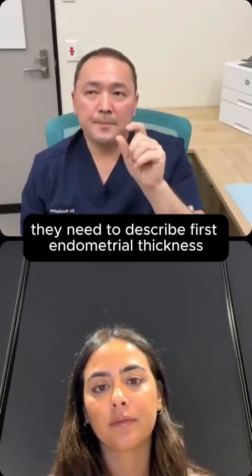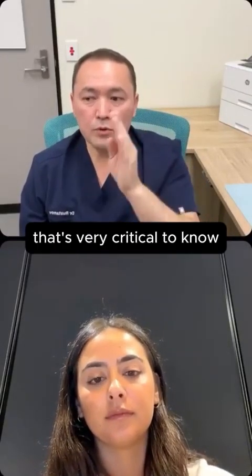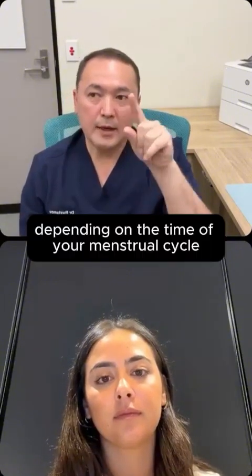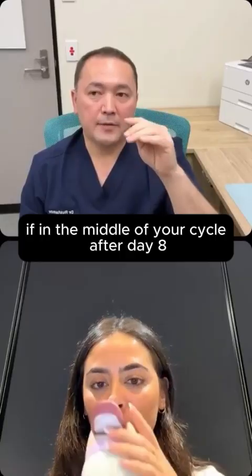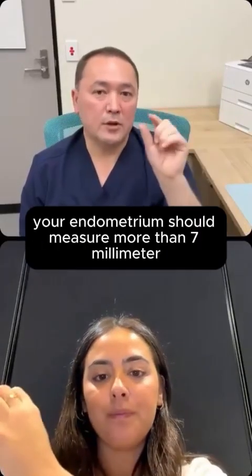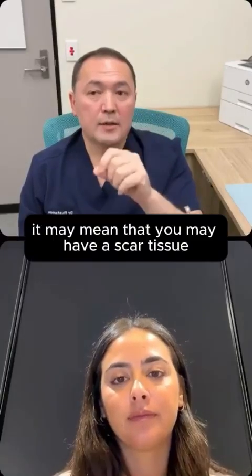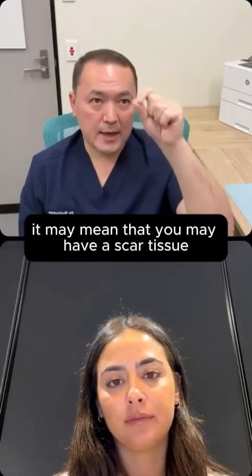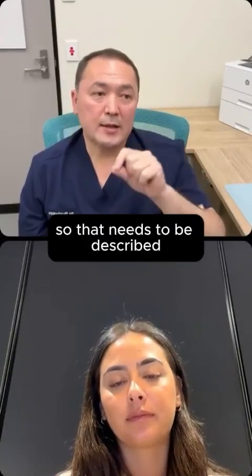They need to describe first the endometrial thickness. That's very critical to know, depending on the time of your menstrual cycle. If in the middle of your cycle, after day 8, day 9, day 10, your endometrium should measure more than 7 millimeters. If it's thin, it may mean that you may have scar tissue or Asherman syndrome, adhesions inside the uterus. So that needs to be described.